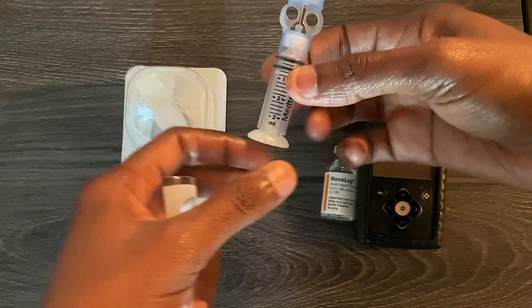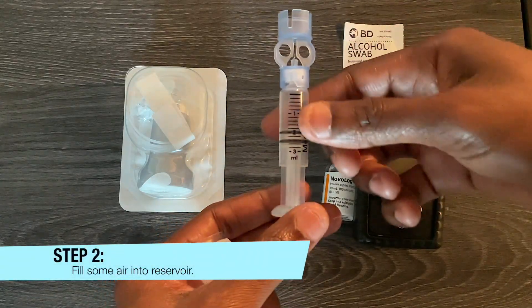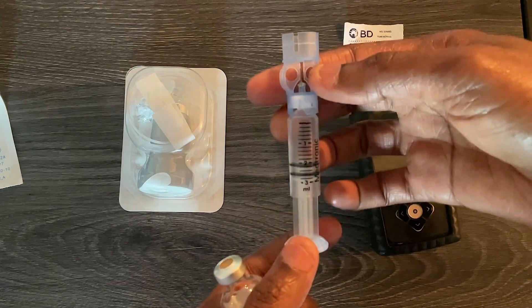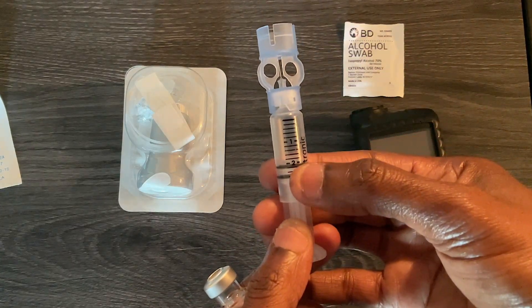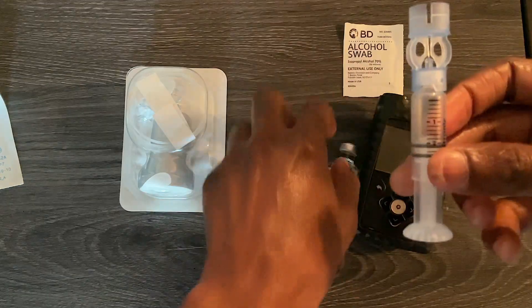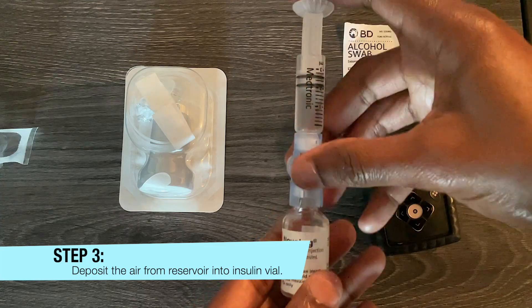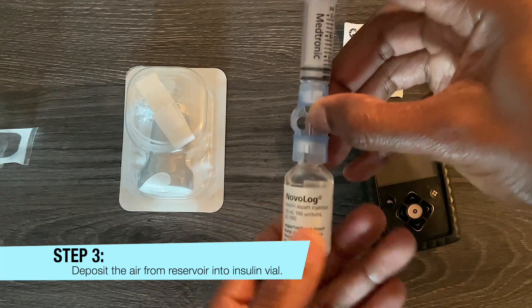Remove the reservoir. Pull the bottom of it in order to put some air into the reservoir. After filling the reservoir with air, fill it to number two — that's how much insulin you want. Take your insulin and insert the reservoir into the insulin vial, then force the air inside of the vial.